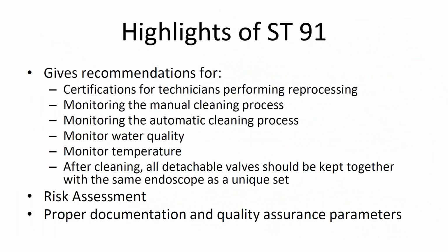This is a very, very high-level look at some recommendations that are found in ST91 that you and your facility may not be currently doing or may not be familiar with. So again, this is just high-level recommendations. I do recommend highly that you get a copy of ST91 for your facility so that you can delve into this in much greater detail. And you can do that on the AAMI website. That's aami.org. But just as a high-level review, there are recommendations that the reprocessing technicians in your facility are certified. There's also recommendations to monitor the manual cleaning process for endoscopes and also to monitor the automatic cleaning process for endoscopes. There's also recommendations to monitor water quality used in reprocessing and to monitor the temperature of chemicals that are used. This could be your detergents, could be disinfectants, anything that has a temperature recommendation on the label.